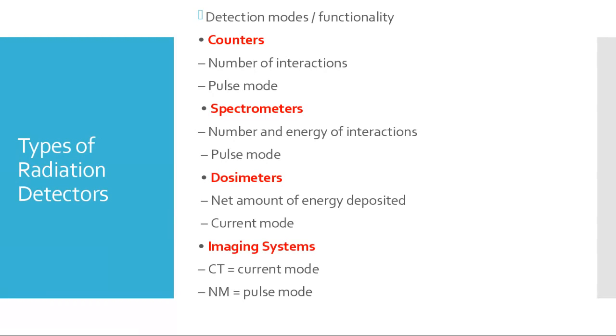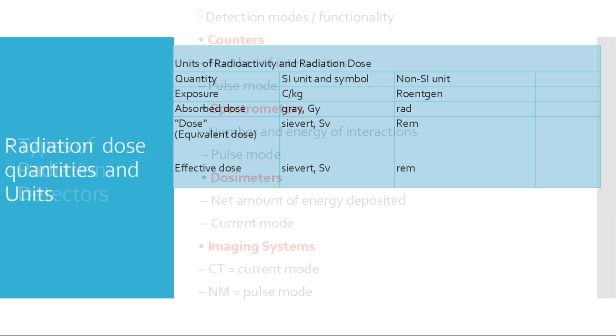As you know, an X-ray image is a shaded image. According to the amount of radiation transmitted to the other side, we can decide whether it is hard tissue or soft tissue. And you know that X-ray is basically transmission imaging.